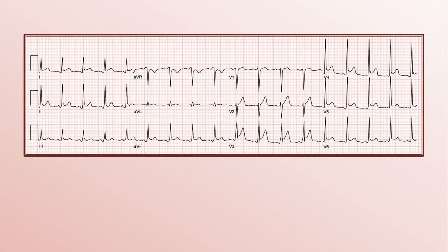To start us off, we have a middle-aged person with no significant past medical history who presents with two days of progressive, constant, non-exertional chest pain. The first thing you probably noticed was ST elevations in some leads, but if you look carefully, you'll see mild ST elevations in almost every lead. The combination of chest pain lasting more than a day and ST elevations that span more than one vascular territory is most consistent with pericarditis.